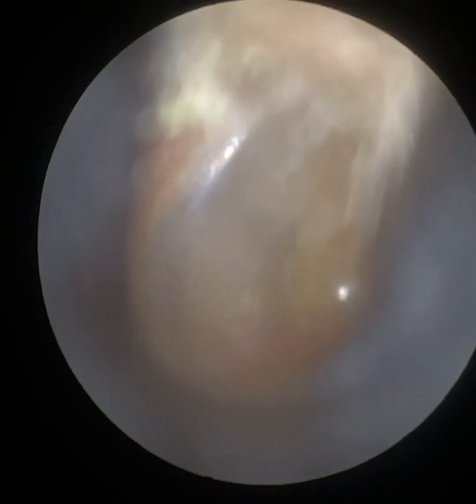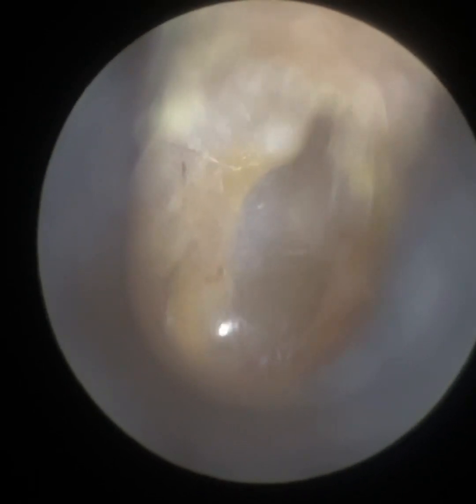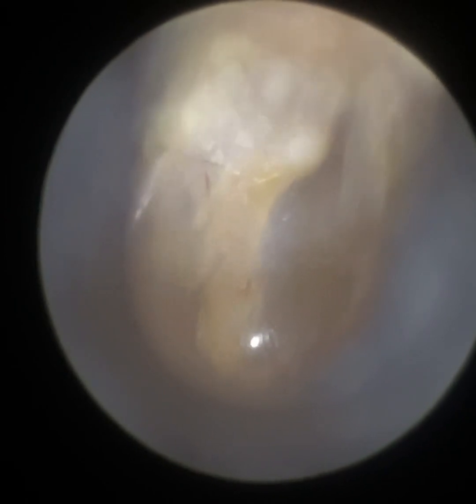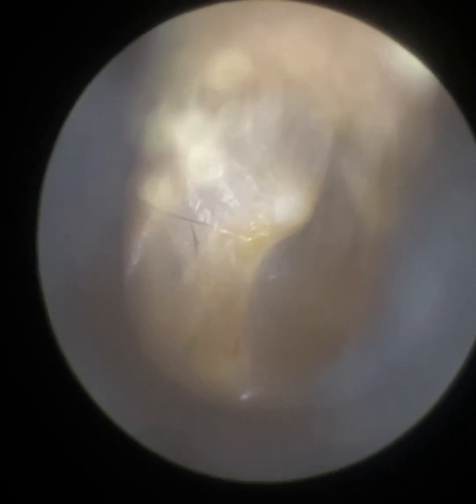So there we are. I'm just going to insert the speculum in and get the tympanic membrane in focus so it's all visible. You can see the short process there, the manubrium, the umbo, the light reflex, and the annulus.